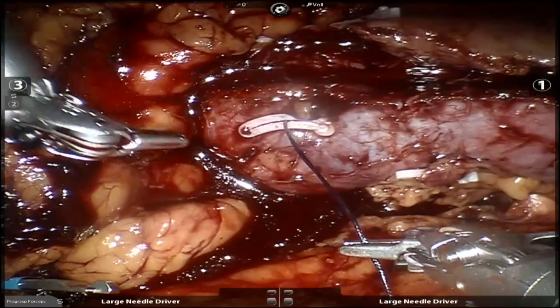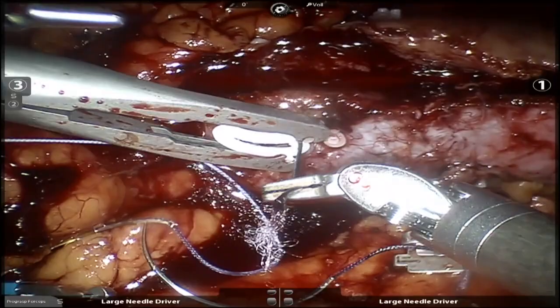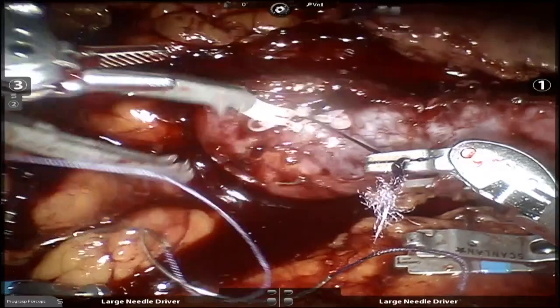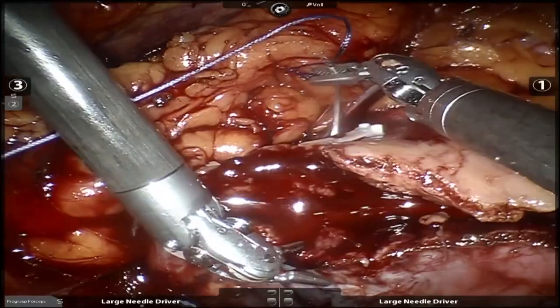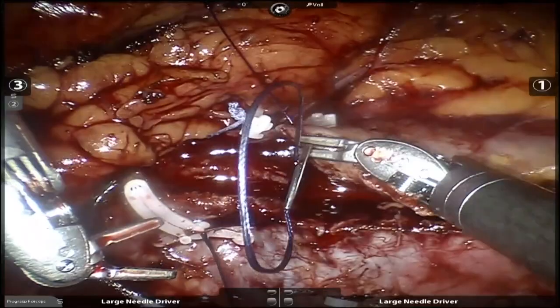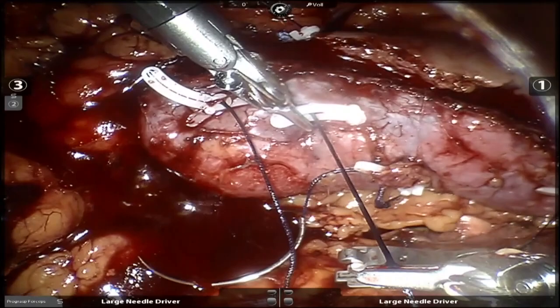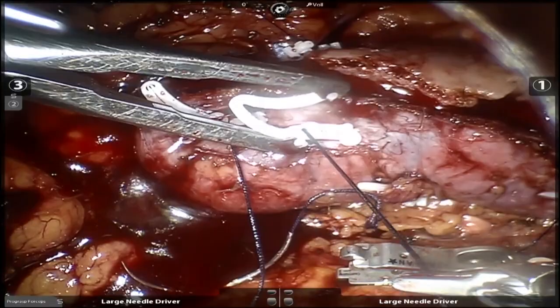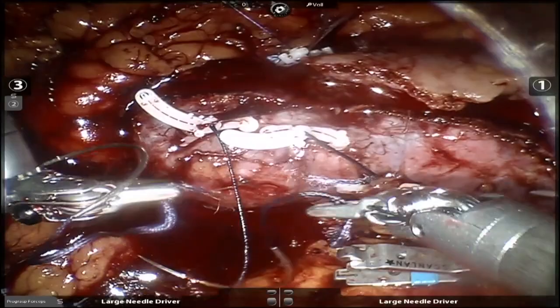Give me a Hem-o-lok right now. Let's do another Hem-o-lok right now. Drop it. Go. Go ahead, Brando. Quickly. Yeah, in the corner. No, you got to hook it. Hook it, yep. Take these two out.